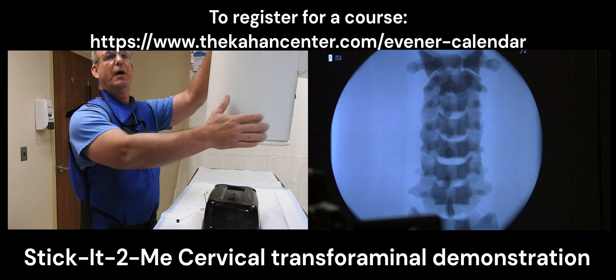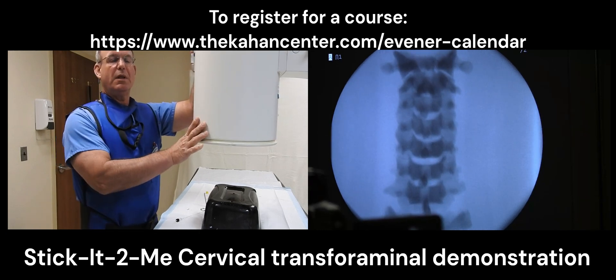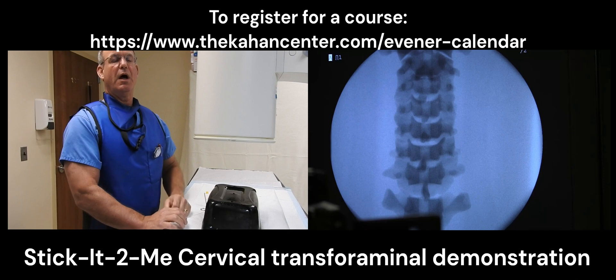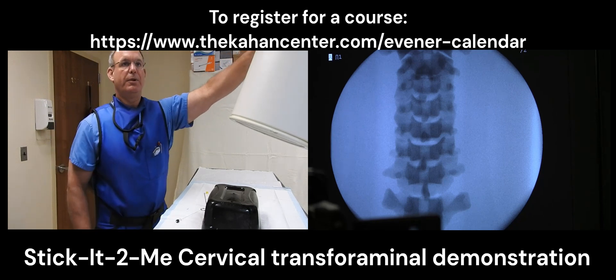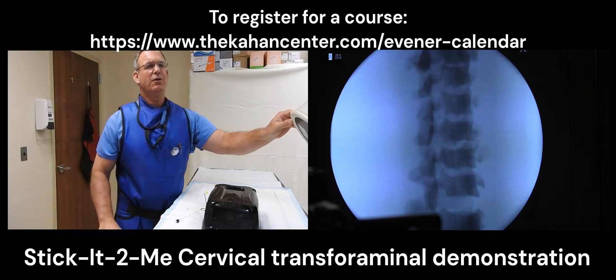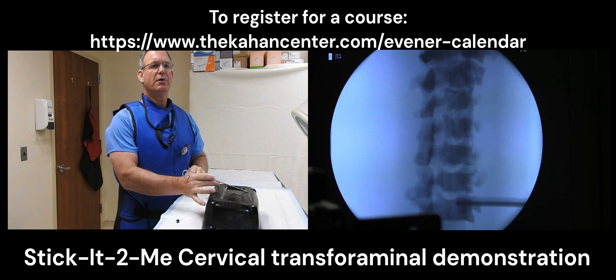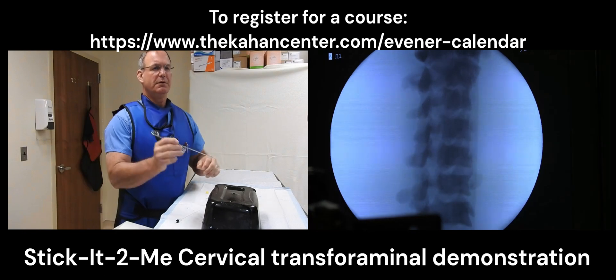Under fluoroscopic guidance I will line up so that the cervical spine is midline. I will make it so that my spinous processes are also midline and that vertebral body end plates are lined up parallel. Once I have everything lined up under a PA view I will then oblique it towards the left so that I have a nice view of the neuroforamen. As I get into that neuroforamen I will adjust it so that my end plates are parallel to each other. Then we'll try to maximize the neuroforamen which we have here.